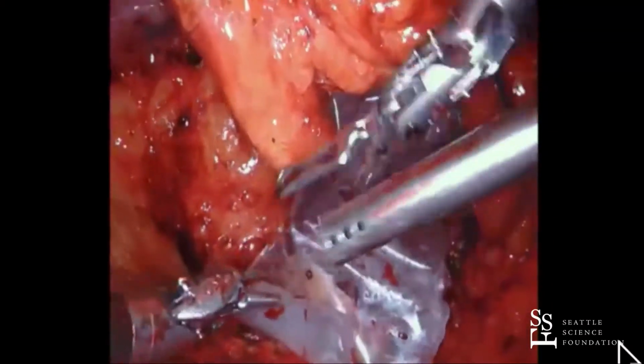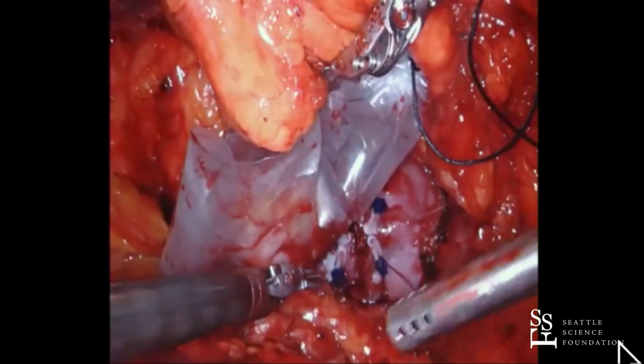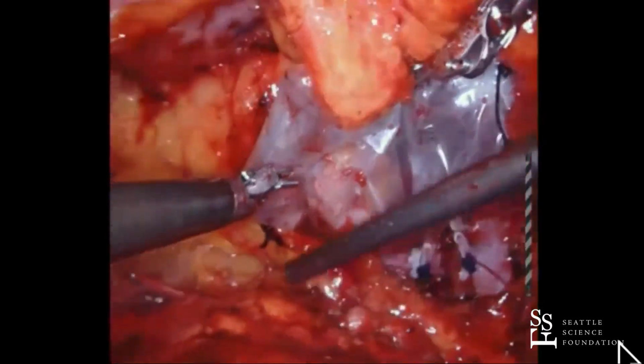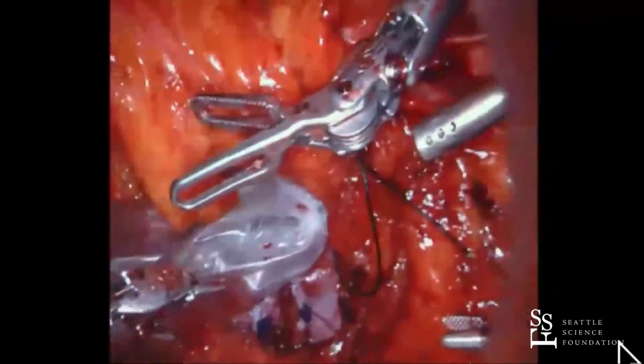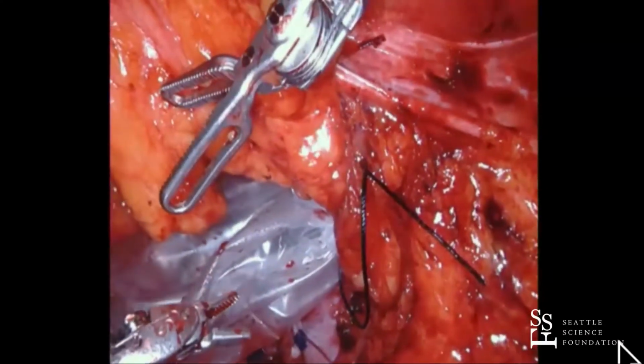I don't think we need a drain. I don't think there's going to be much here, but if there is any blood, it just tends to stay in the space because it's a small space, and then it comes out to the skin. So we've gone back to a drain after many years of not doing it. A couple cases always change your mind. So, we'll put a drain in, extract the specimen.